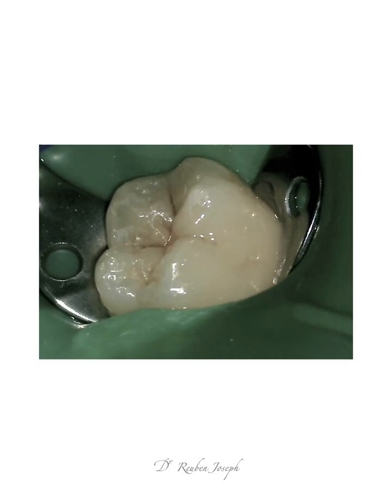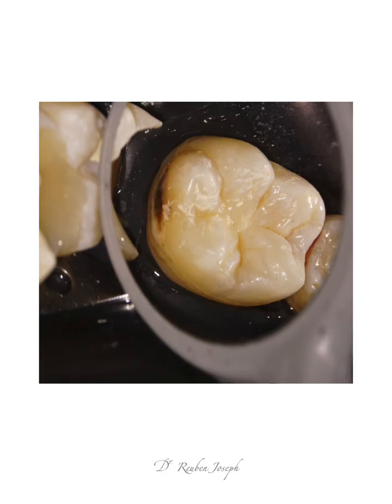So when it comes to taking pictures through a microscope for endodontic purpose, rarely will you get the opportunity or the requirement to take a picture like this. And almost always it is going to be an indirect image that is captured using a mouth mirror. So the mouth mirror you use is largely going to influence the outcome of your image quality.